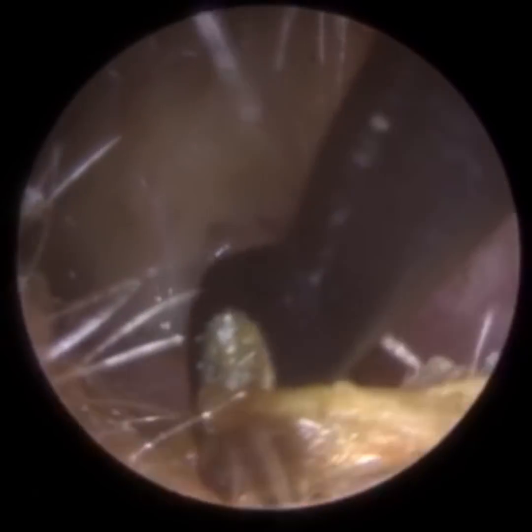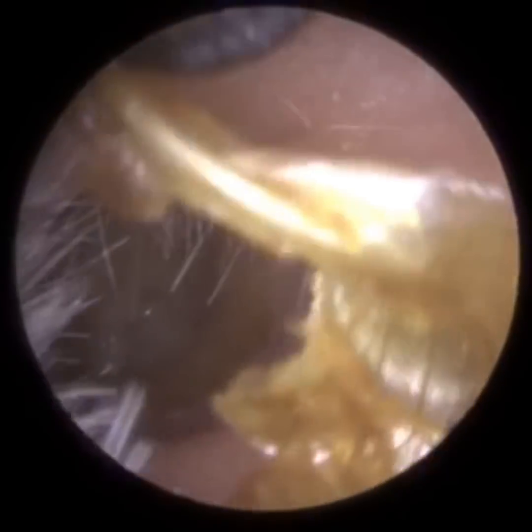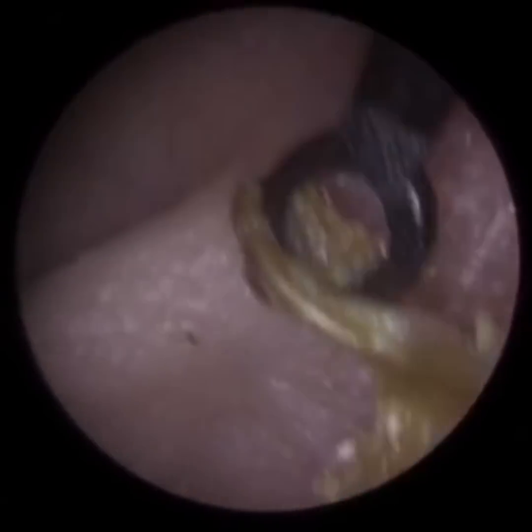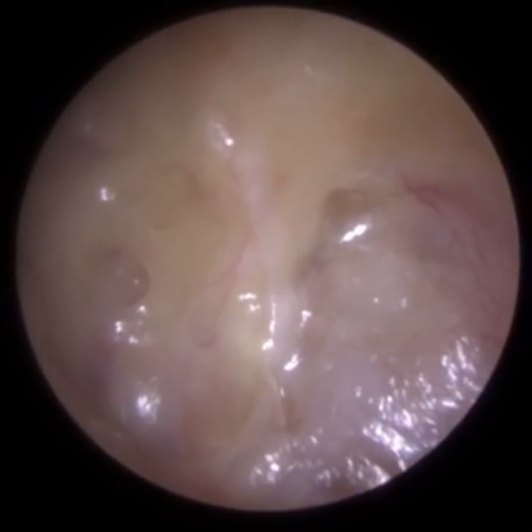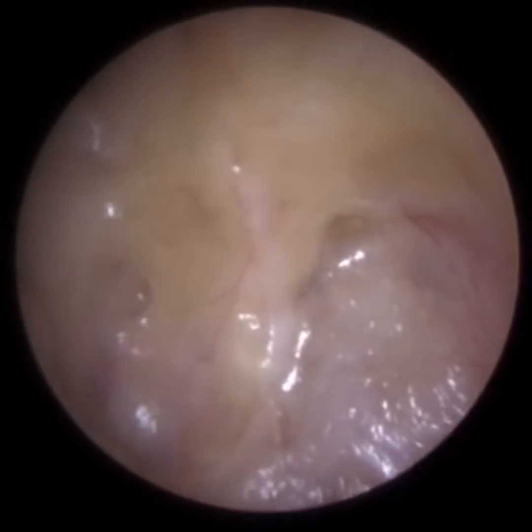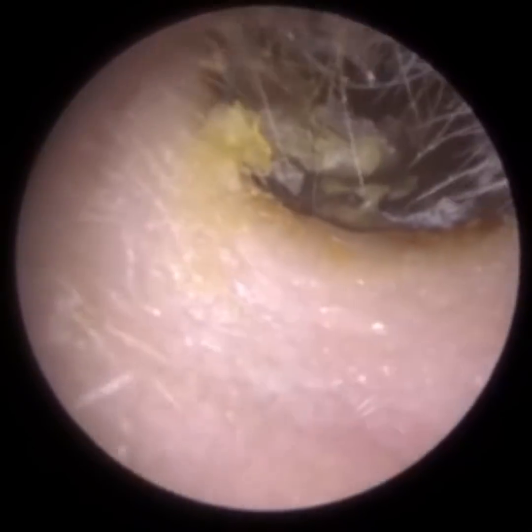When you get access to the middle ear, they lift the eardrum — almost like a door. They dissect it, lift it up, create a flap, chisel out all the bone. The reason for chiseling out the bone is to get access to that cholesteatoma, remove all the cholesteatoma, and then reposition the eardrum back.